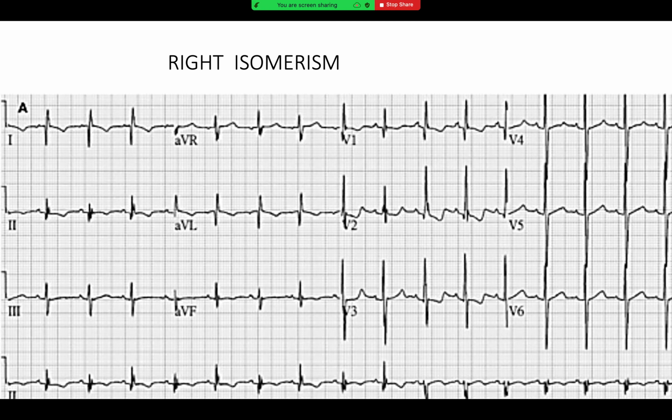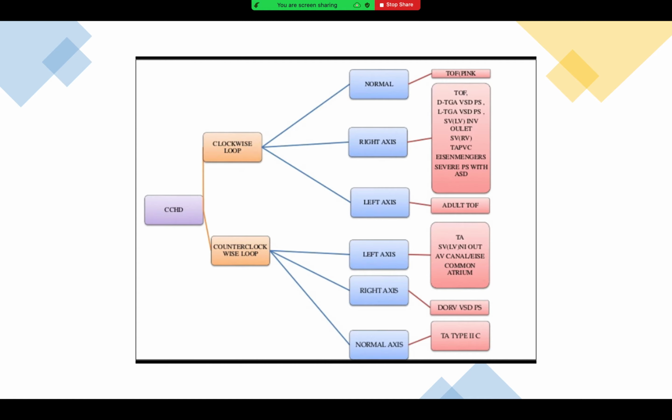And the right sinus node is the dominant pacemaker. So that's why alternating QRS patterns can be seen, which could be due to the antegrade conduction through either one of the two AV nodes. So a lot of times we can notice PSVT, paroxysmal supraventricular tachycardia, due to re-entry between the paired AV nodes. So this is how you differentiate.